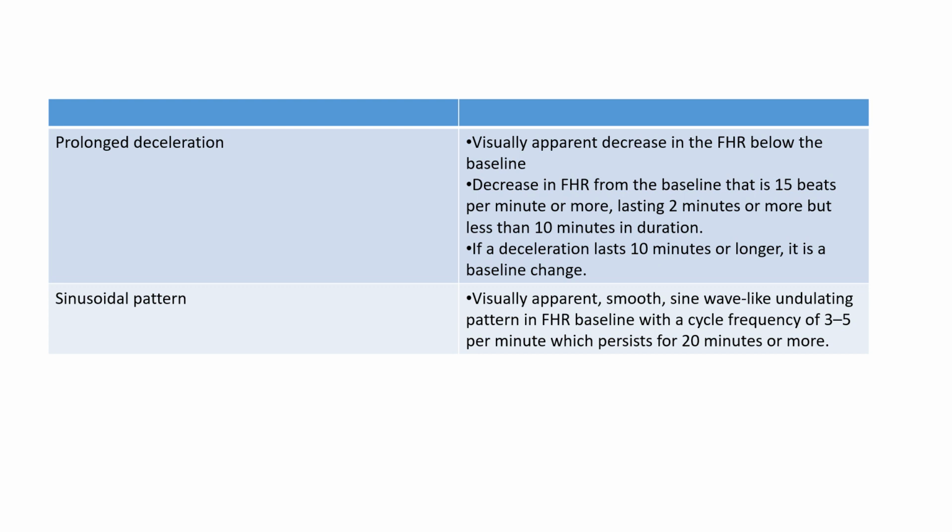Then there's another two definitions. One is prolonged deceleration, meaning that the decrease in the fetal heart rate is more than 2 minutes but less than 10 minutes, because if it's more than 10 minutes it's going to be a change in the baseline. Another very worrisome and ominous sign is called sinusoidal pattern.